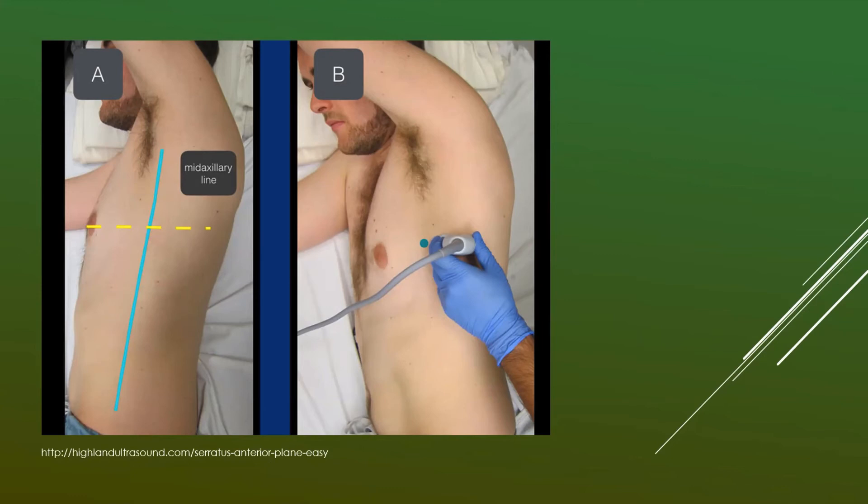The indicator orientation depends on which hemithorax you're performing the procedure on. In general, when doing ultrasound-guided procedures, you want the indicator facing your left. Regardless of which side of the patient you're on, always keep that indicator on your left — that way, when your needle comes in from the left, you'll see it on the left side of your screen, making it much easier to localize.